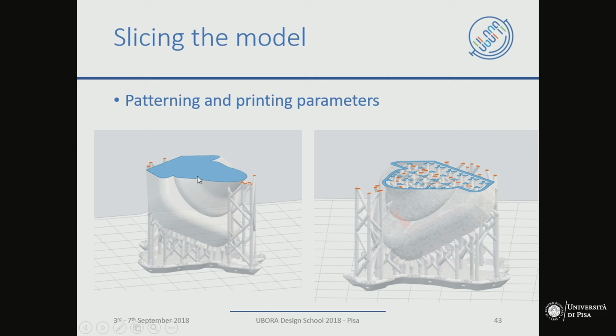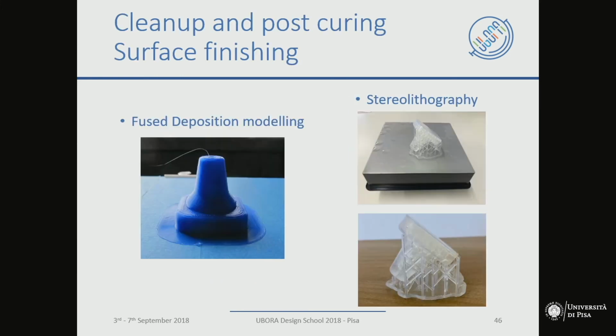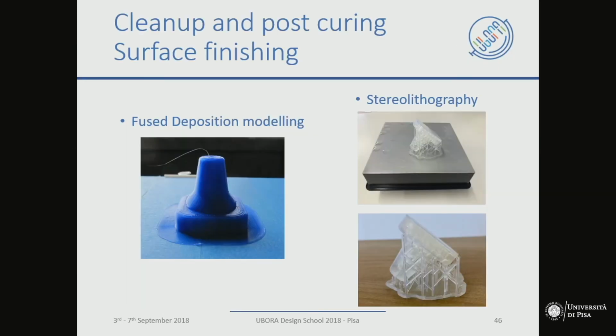You can decide to print it as a solid object, so completely full of material, or you can have an internal structure. Then you have to print how you prefer. And after that, you have to finish it.